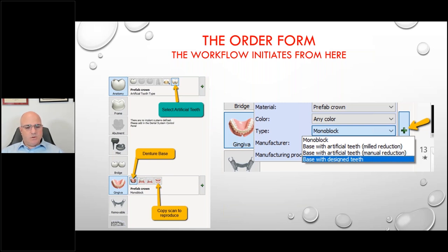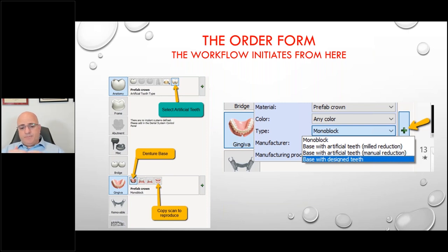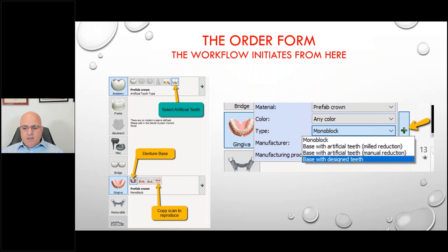The order form is the hub where you indicate what kind of workflow you want to follow. In Three Shape, you set it up by selecting the artificial teeth first and foremost, then selecting the type of denture base — whether carded, mono, or a separate arch with denture base. You can even do it in quadrants, individual teeth, or in three sections — anterior and distal — or a full arch. Different companies feel one workflow is better than another, but it's really what's most efficient for your laboratory.